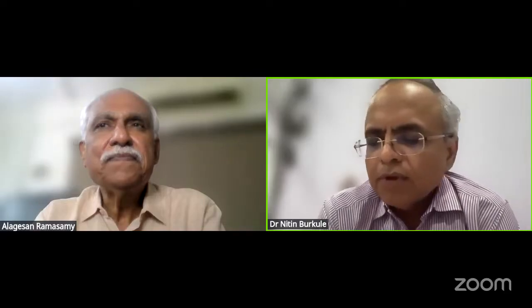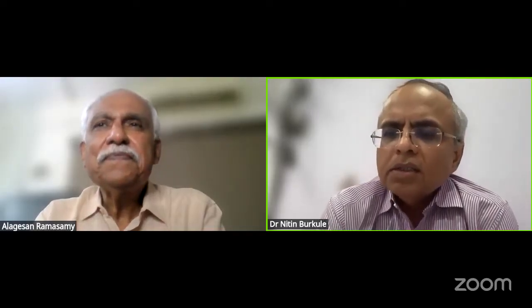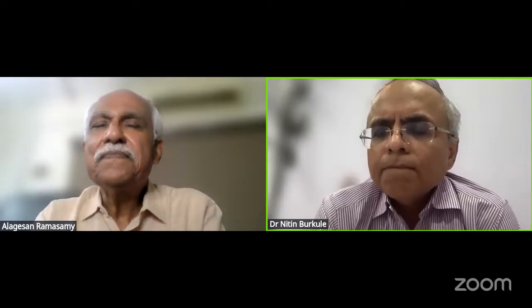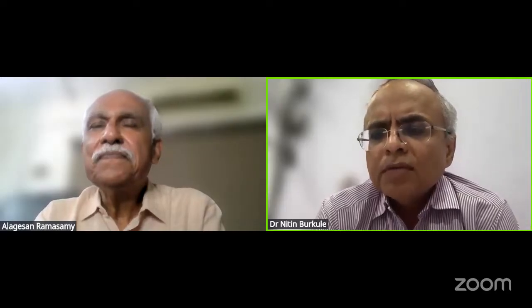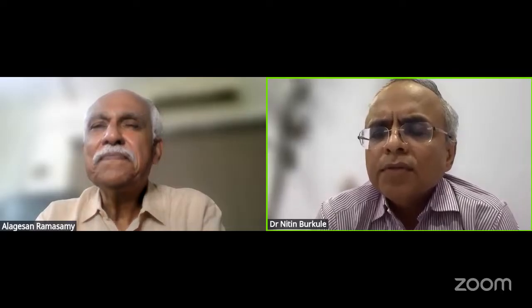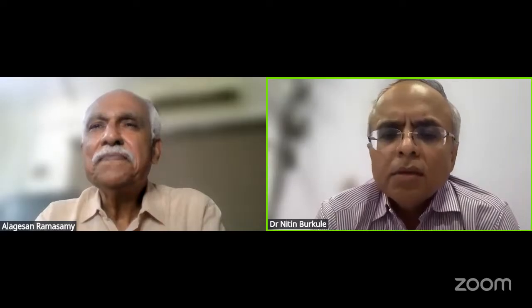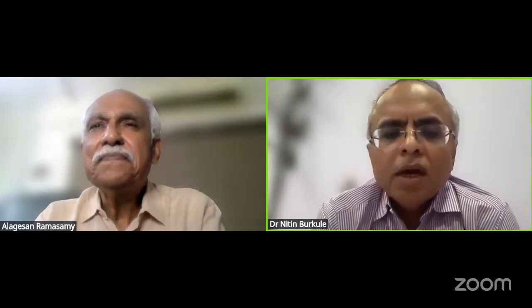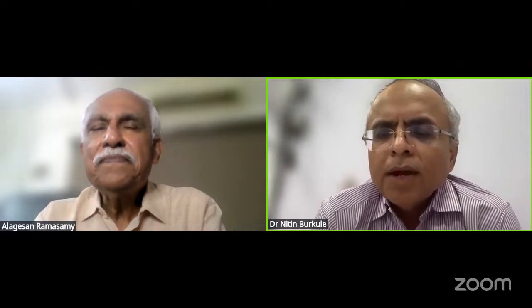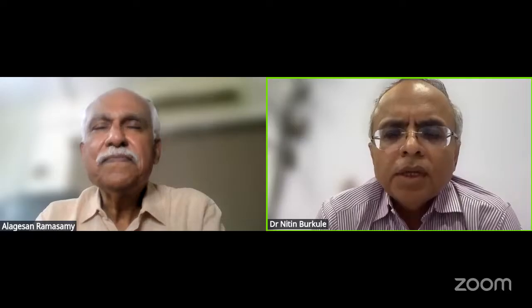This particular individual in the family is probably developing hypertrophic cardiomyopathy, because then we will not wait for 15 millimeter to diagnose it. So that is the perfect one. Secondly, there is a question framed this way: suppose the hypertrophic cardiomyopathy patient has a preserved EF, are there any echo parameters which will predict the progression, that means probably the outcome? So, what are the bad prognostic features on the echo in hypertrophic cardiomyopathy?